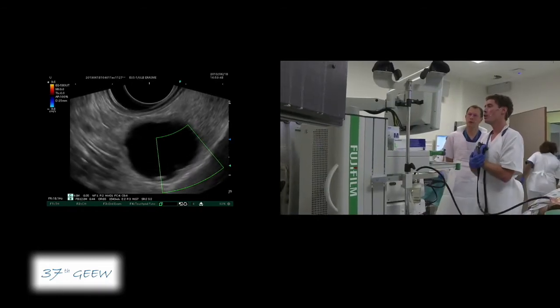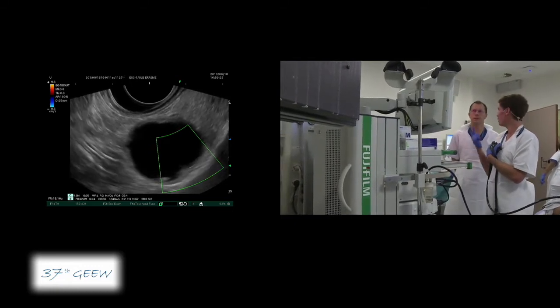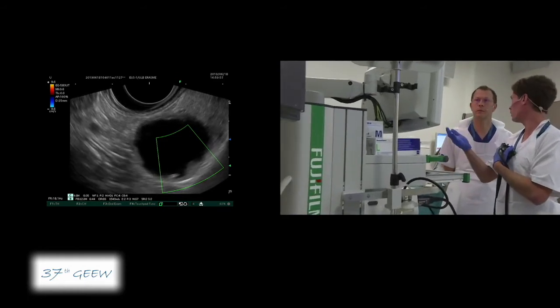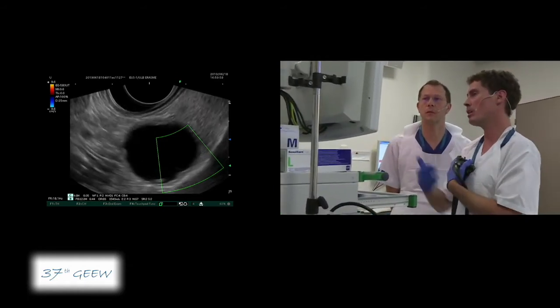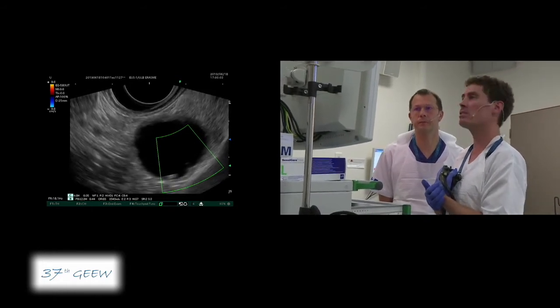We say mucinous cystadenoma: lady, tail, the age, non-communicating with the duct, and maybe debris or wall thickening. So mucinous cystadenoma. And the second one, I would say, cystic neuroendocrine tumor.